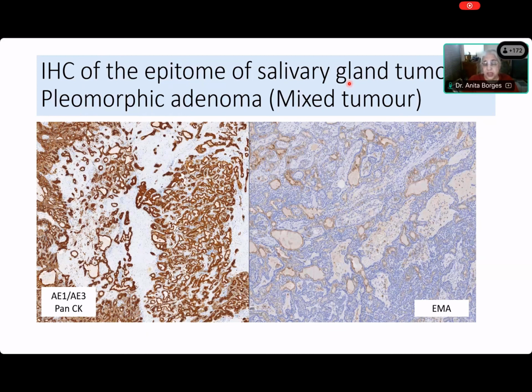And you see so beautifully over here how these false lumina are being produced. If you can see my cursor, or maybe I'll take another color and show you. Look at this. Oh, that's still red. Sorry, let me take another color. Yes. Okay. Now you see this green thing. Have you seen how these myoepithelial cells are secreting this myxoid, and then they're forming. I'll just erase all the stuff and then I'll try it again. Okay. Now let's go to the cursor again.